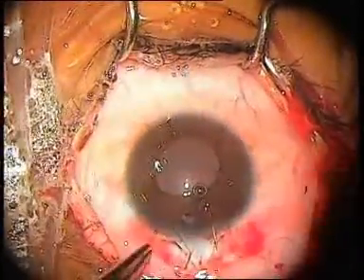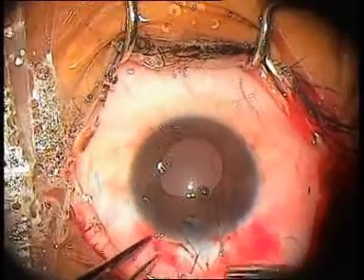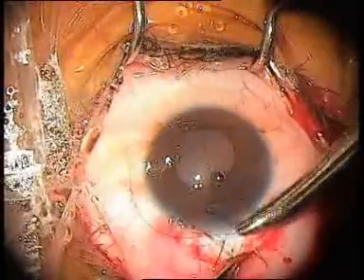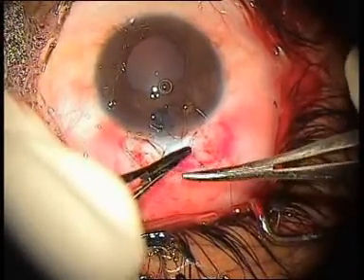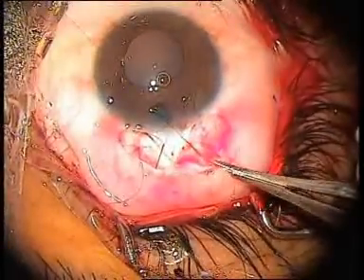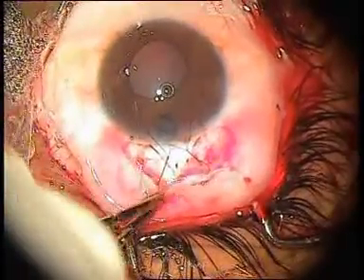Similarly, a releasable suture is placed on the other end of the flap margin. The ends of the first bite of the releasable sutures are cut 0.5 cm long.